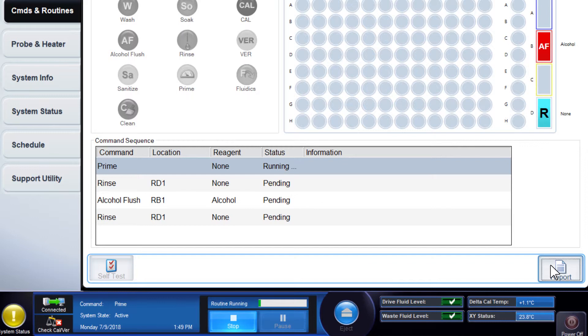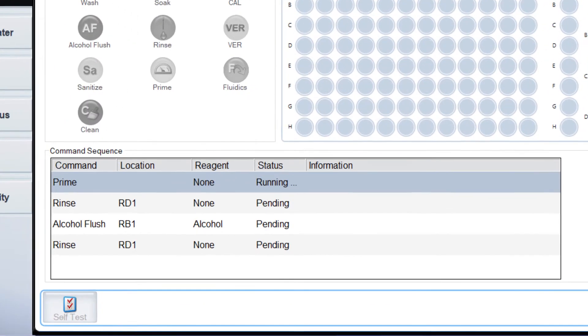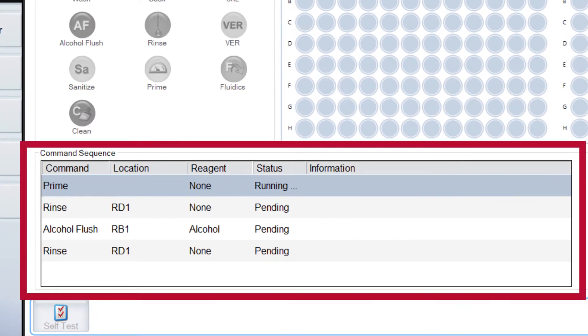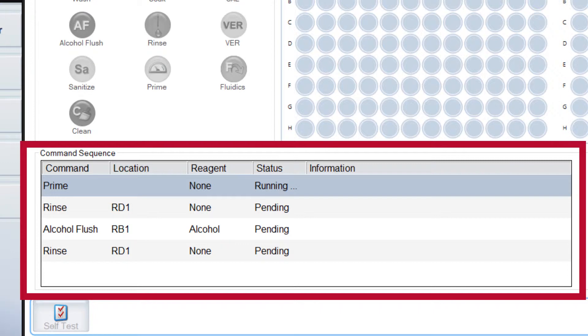The Revive After Storage routine performs the following commands. A Prime, which removes air bubbles from the system's fluidic pathways by drawing drive fluid from the drive fluid container.